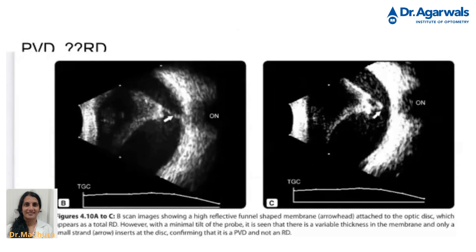This does look like a retinal detachment where you can see a tented membrane, but when we do a dynamic scan — asking the patient to move his eyes up or down — you can see that the thickness of the membrane is variable and only a small strand is attached to the disc. So this is a PVD and not an RD.